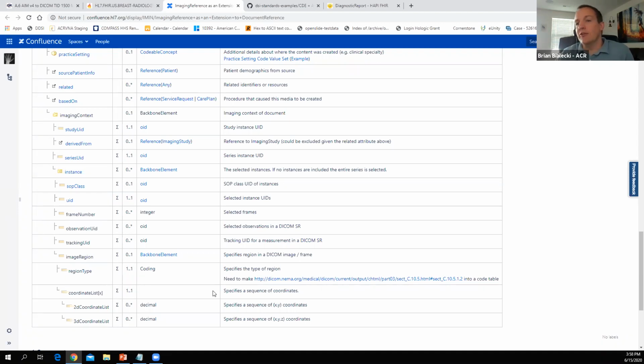But if I want to get into specifying an entire volume, I'm not sure that I can specifically do that, or if I'm going to have to create additional DICOM series and just point to those particular series, or if anybody has seen ways coordinates are listed in other resources that I may be able to use in the future.